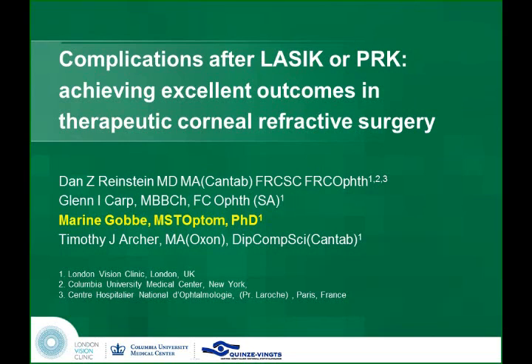Sorry. I was going to add that also in the hyperopic wavefront-guided repairs, you still focus on the middle of the pupil, whereas they tend to have large angle kappas. So topography-guided, decentering your ablation to the visual axis, is going to give you a much more beneficial effect in controlling the aberrations compared to the wavefront-guided treatments inherently, unless they have a very, very small angle kappa.